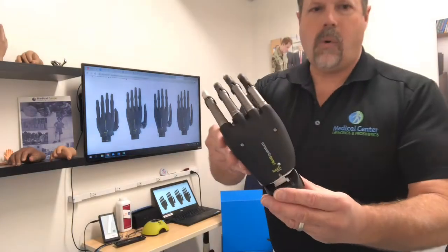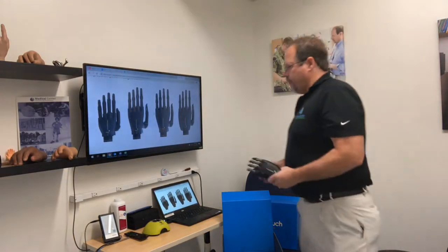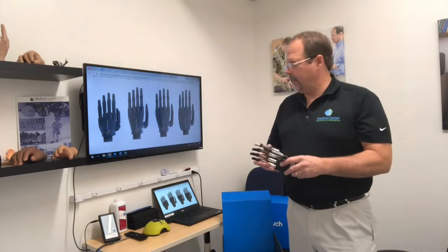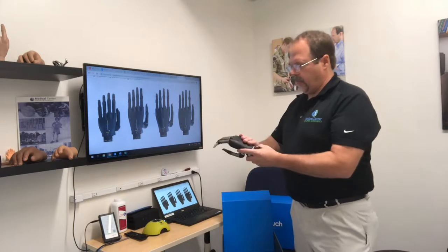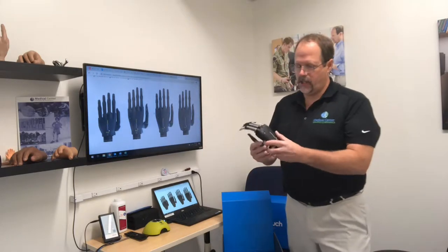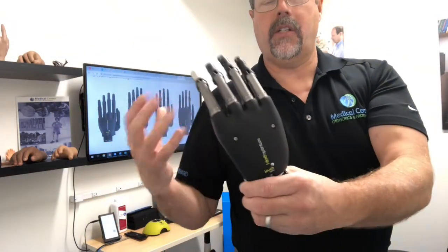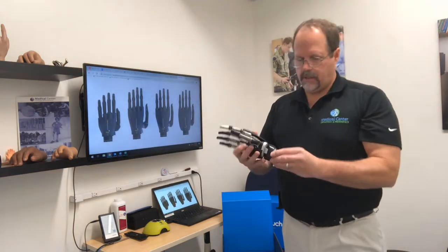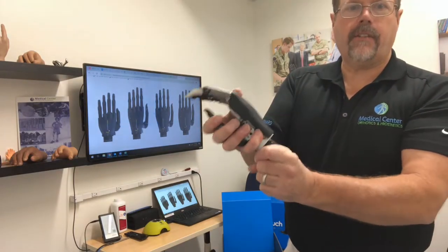This is the iLimb Quantum Titanium — I think it's the most advanced hand. The iLimb Quantum Titanium is a very nice device. As you'll see, it's available in several different sizes. The one I'm holding represents a larger one with a fuller handshell. This patient has a little larger hand and wants that fuller look. It has a nice flexion wrist that's an option — they can lock in flexion and extension.